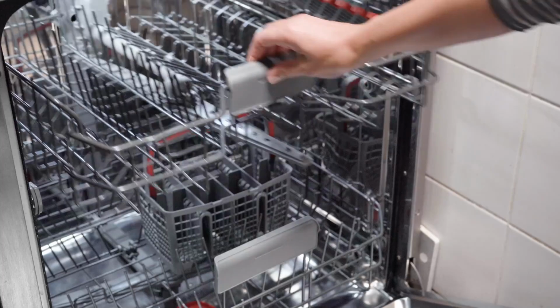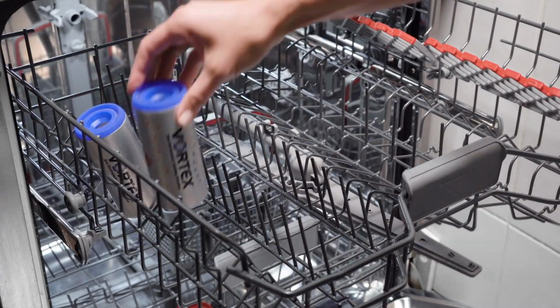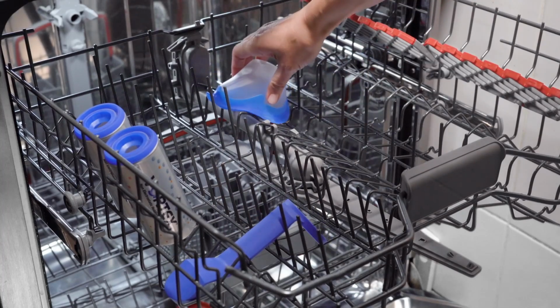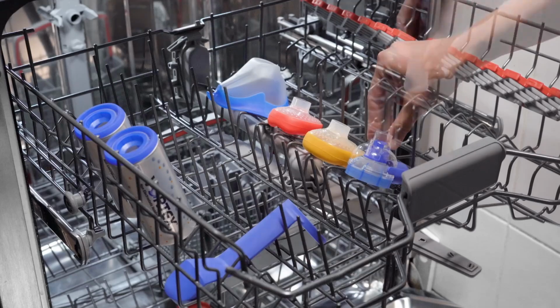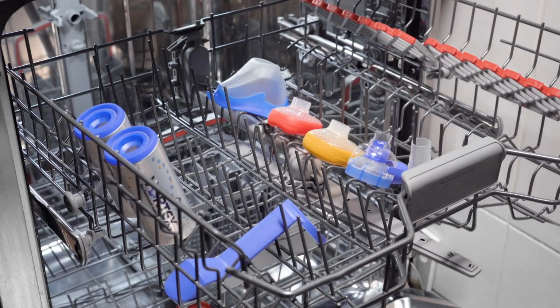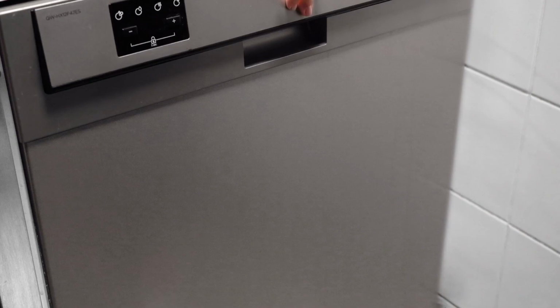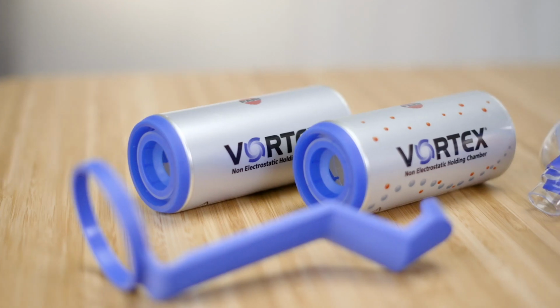Alternatively, place the parts in a dishwasher connected to a main water supply. It's important that you do not clean the vortex together with very dirty dishes. Position all parts so that no water can collect in them. Select a program with at least 50 degrees Celsius.